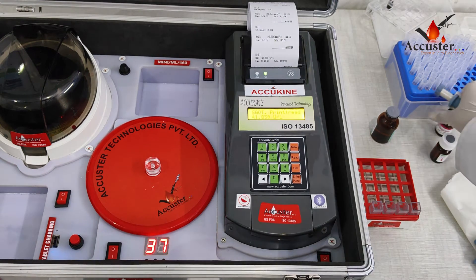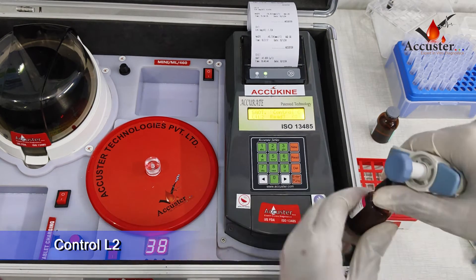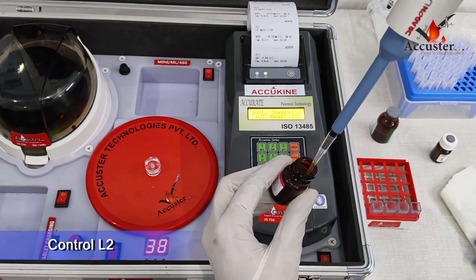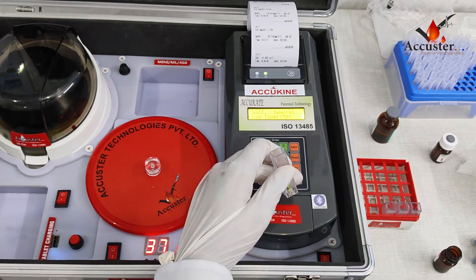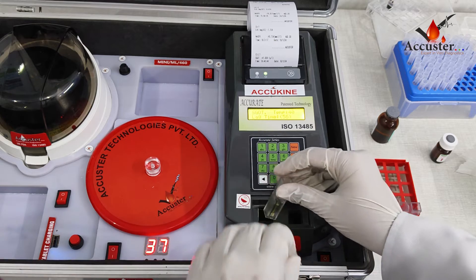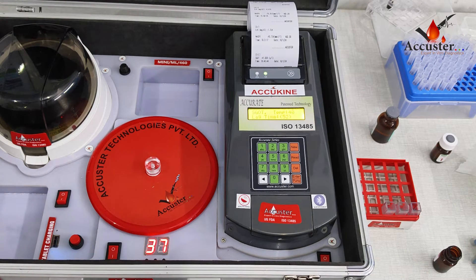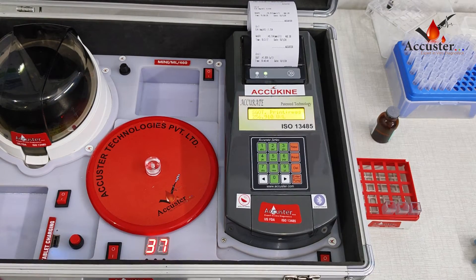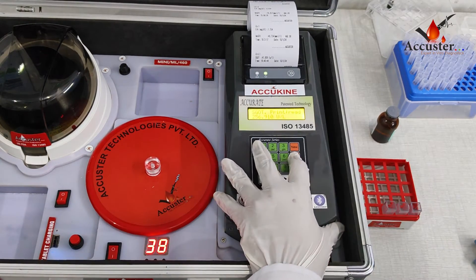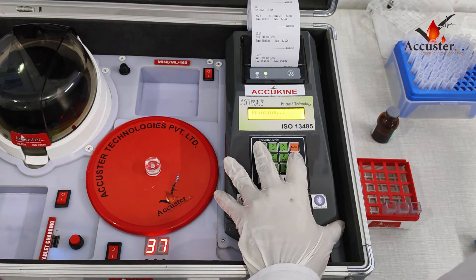Repeat the same process with L2. Take 500 microliters of reagent and mix it with 50 microliters of L2, then put the cuvette in the analyzer and press ENTER. The reading will appear after 4 minutes. Now we can see the reading. Then press the READ button to print the result.